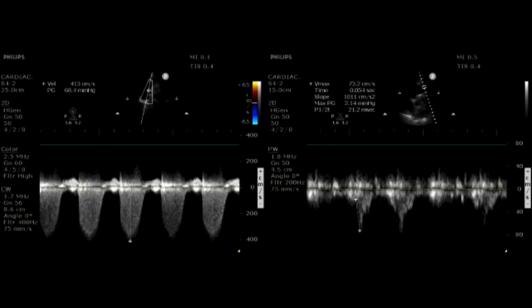And I think based on the test characteristics of this thing, it certainly is going to be enough that if you scan a patient, you see this, and the clinical situation fits, you just go get that CTPE and make the final diagnosis there. I think maybe one more question for you, Ashish. We can kind of squeak this one out, and then we'll wrap up officially.